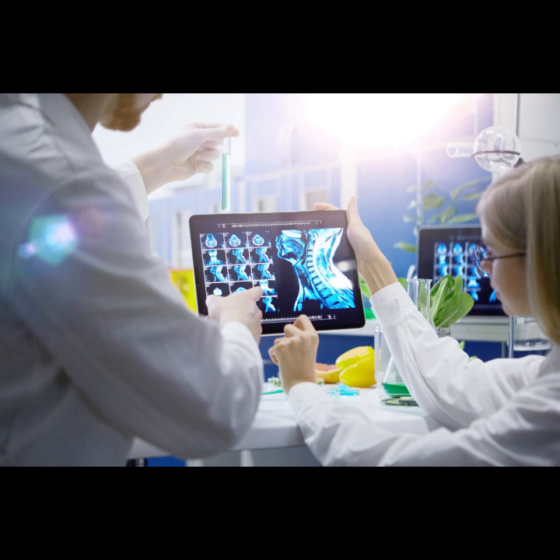Now, the strategies. How do we actually chart k-space? You mentioned hundreds of ways to control the gradients, G of t, to trace that path k of t. Yeah, it's a whole field of engineering, pulse sequence design. Broadly, we can think about multi-shot versus single-shot techniques. Multi-shot being the traditional way.